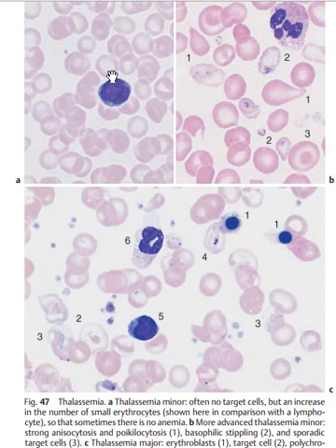So you see here in thalassemia minor, normally there is no change in the shape. There's only hypochromia, and there is normal size. The cells are small, but there is no variation in size. And when the thalassemia is now advanced, is it clear? Thalassemia minor is now advanced. You have both anisocytosis and poikilocytosis. Is it clear? So here you have no anisocytosis, no poikilocytosis.